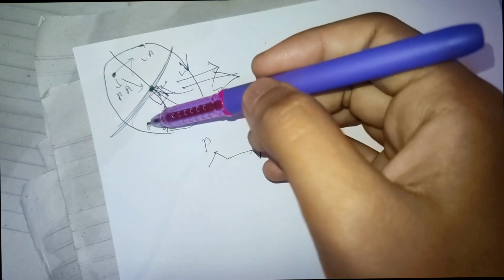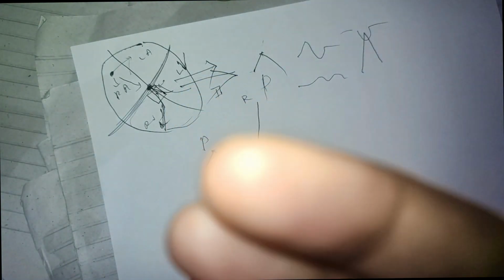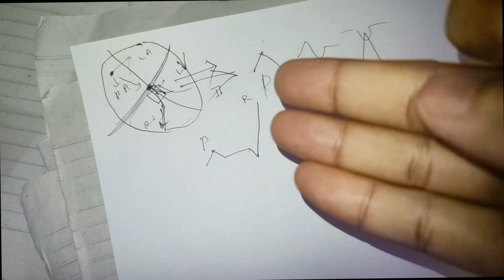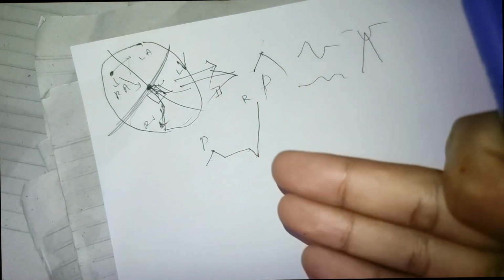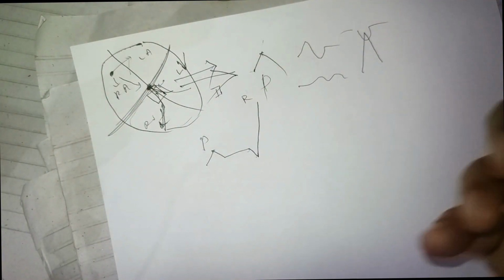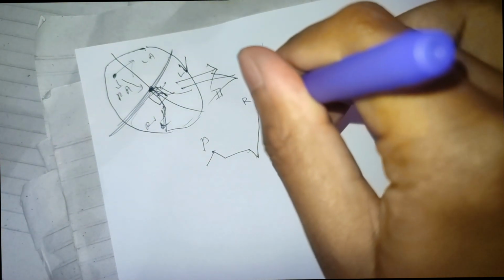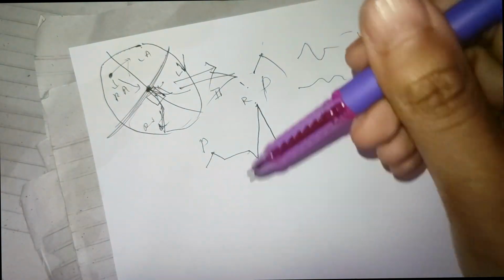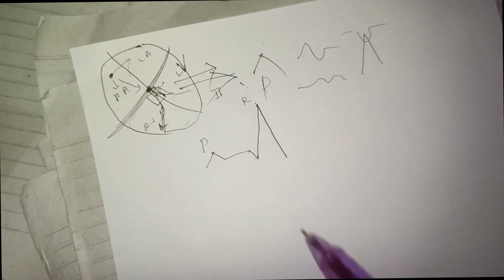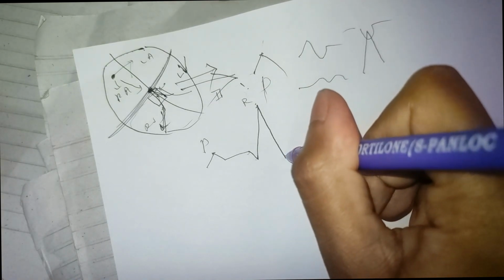Now this anterior portion of the ventricle has depolarized, but the posterior part of the ventricle also needs to be depolarized, because the current is not just on the anterior part, it also needs to travel to the posterior part. So the current now moves in this direction to depolarize the remaining ventricle, the basal portion of the heart. So since the current is moving in this direction, now the pen deflects like this, because this is recording from this point, right? So now at this point ventricular depolarization has completed.